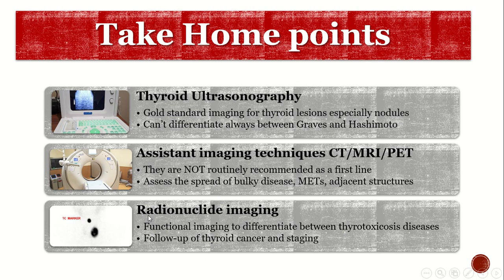The radionuclide imaging is a functional imaging to differentiate between thyrotoxicosis diseases and follow-up of thyroid cancer and staging.